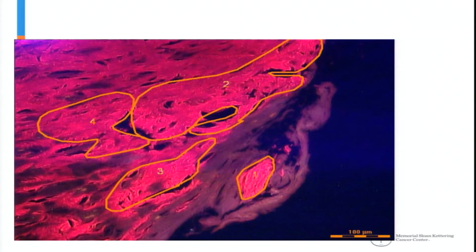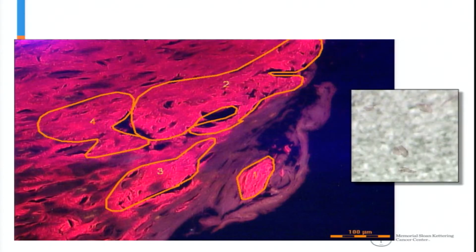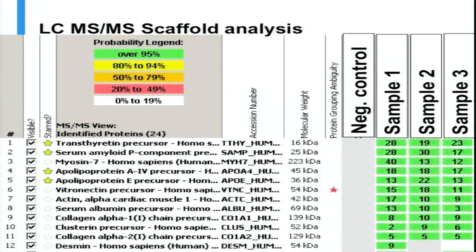And this is the cardiac case I just showed you, which was diagnosed as AL lambda. And here is the list. You can tell me whether this is AL lambda or transthyretin. Not very challenging. This is as simple as this becomes, from where we were trying to interpret that mushy immunohistochemistry. The top hit here is transthyretin. There is no evidence of lambda in the top 10 proteins, so it's a no-brainer.